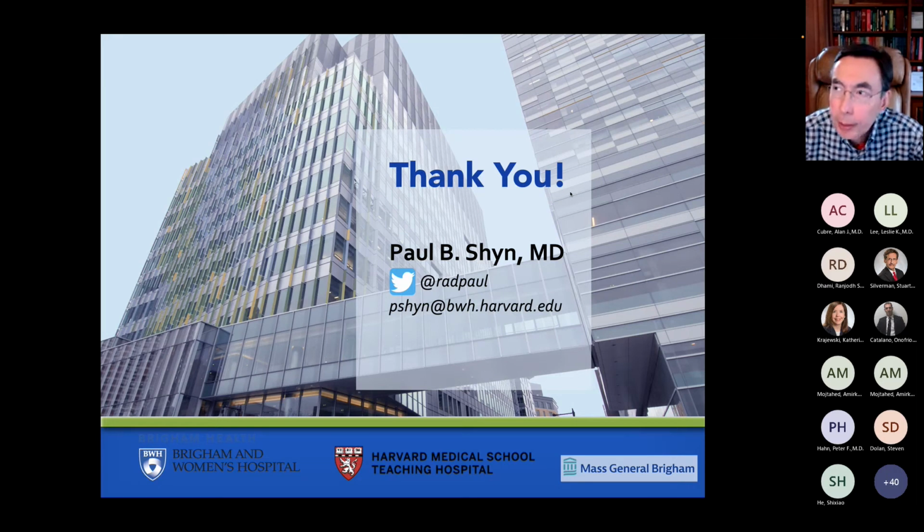Yeah, so I think tumor in vein is seen with cholangiocarcinoma also, and even other malignancies. I was a little surprised at that too. I would have thought maybe two-thirds would be HCC. It depends on what center you're at, but for whatever reason, that was the statistic generated from at least one study. But the bottom line is that if it's enhancing tissue going into the vein, it's almost always malignant, and it may be HCC, but it could be a different malignancy too.